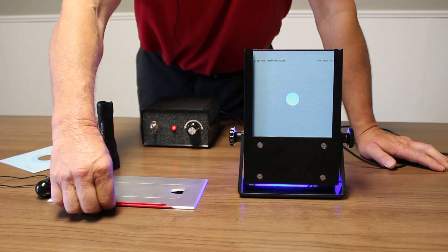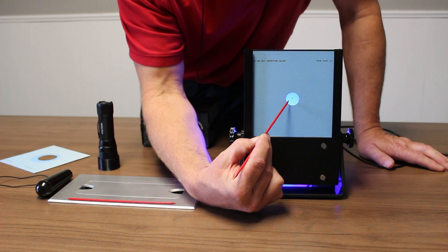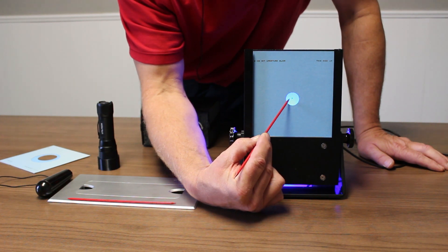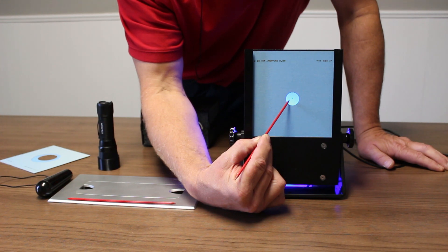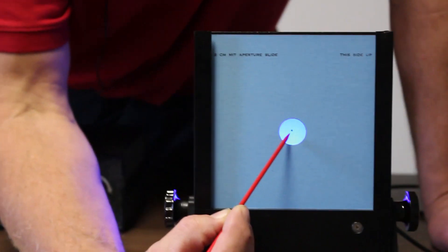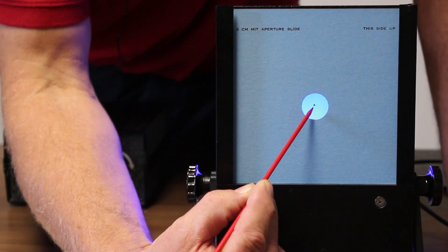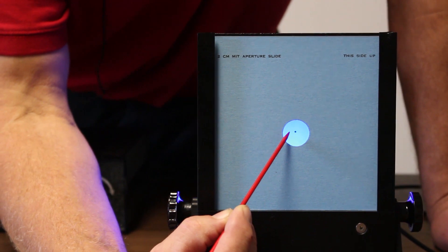The way we treat with this, we'll use a red pointer to put in the equal opposite direction of the propeller and then move this red pointer such that when they're looking at the pointer, we've got the propeller spinning around the dot. The therapy consists of moving the pointer closer and closer to the dot while trying to keep the propeller spinning on the dot. At the point the propeller leaves the dot, we go back, get the propeller back on there, and so on.